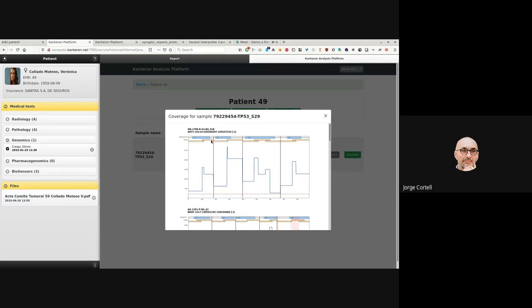So you got to be extra careful with the quality of the data, because if you're going to give a clinical assessment, a diagnosis, treatment, whatever, you need to make sure that the minimum quality standards or procedures are covered.